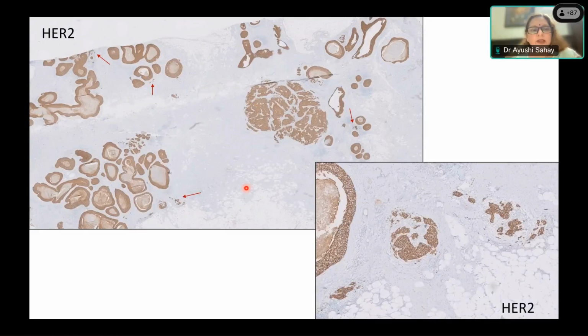Yeah, just one thing to add: when in a core biopsy you have called DCIS or a DCIS with microinvasion and you get the excision of the specimen, you have to be sure to sample the area of abnormality extensively, because as we have shown, in what has been called on biopsy only DCIS, you can have foci of microinvasion, but you will miss them if you do not sample the DCIS extensively. Similarly, even if we have called microinvasive on the core biopsy, you can have larger foci of invasion in the main tumor mass, which again, if not sampled adequately, you can miss.